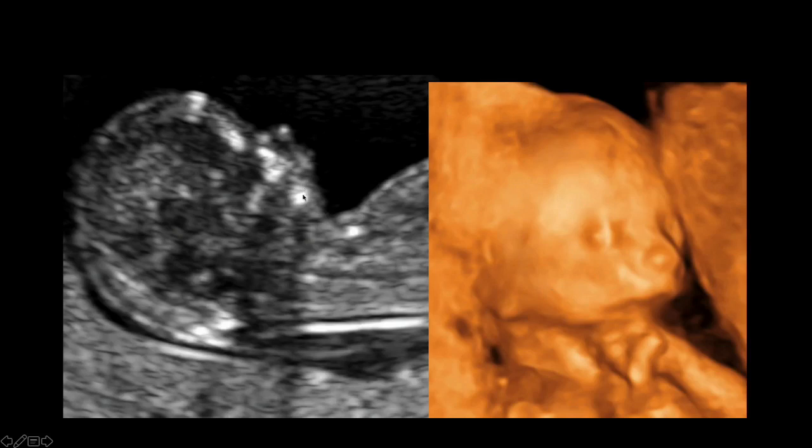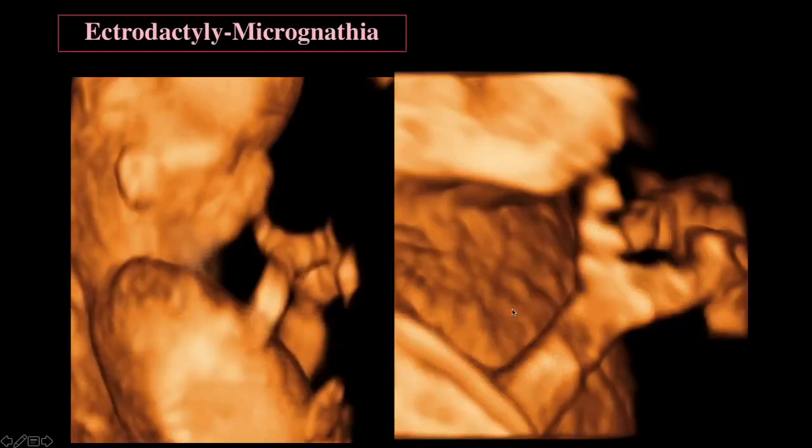Here it looks like it's in a bit of a chin tuck, but if you wait until the fetus jumps up a little bit, you'll find that the chin never really advances. And it is much better seen in 3D, much more dramatic, if you're wondering if it's real or not. And then of course you see the ear is also low set, which also helps to nail this diagnosis.